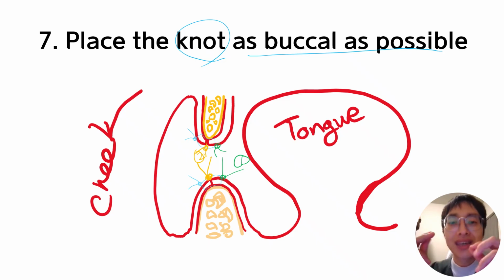You will see some tangled bacteria and plaque around the suture knot, right? We don't want that on top of the incision line, causing infection and delaying the healing. We don't want that to happen.